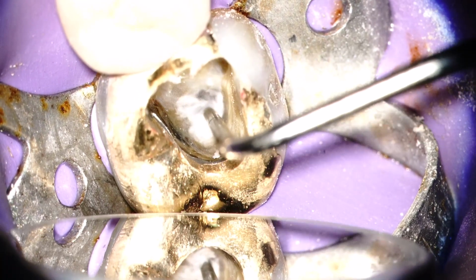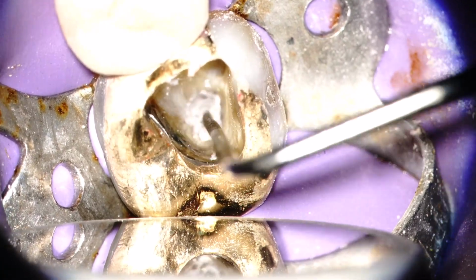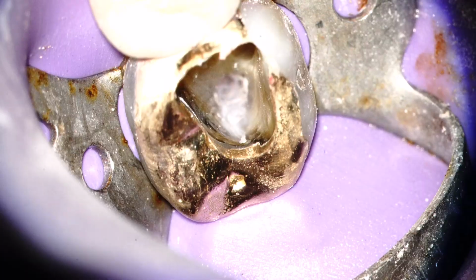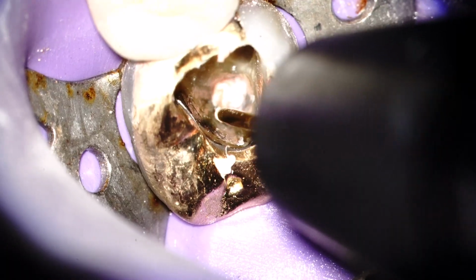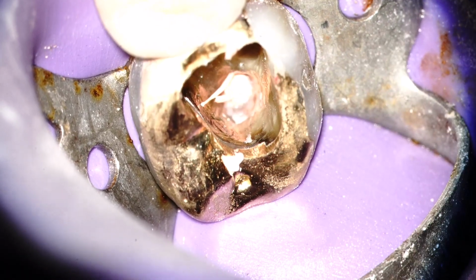Now going again with the 9 plugger. You want to capture the maximum cushion of gutta-percha with the plugger. Again, using the touch and heat. And now applying the hot shot gutta-percha gun and backfilling with the molten gutta-percha.